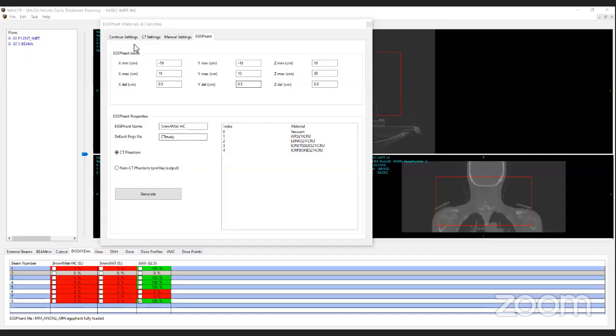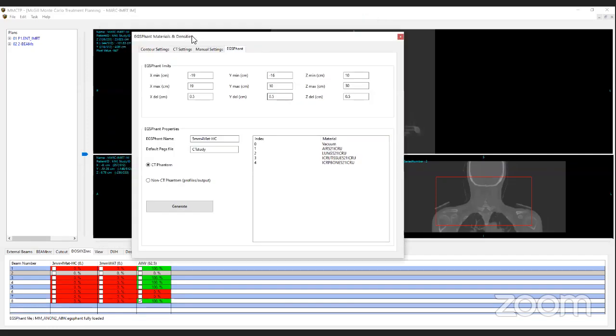The other question, Dr. Wamid: the code you entered on EGS for us to be able to link the EGS with MMCTP. I tried to enter the code and it is giving me an error. I think something like a bash command, which you did before we started this MMCTP. I've tried to enter those codes and it's not going. And I will appreciate if I can get books or materials at least to assist me in my proposal writing. Thank you, sir.